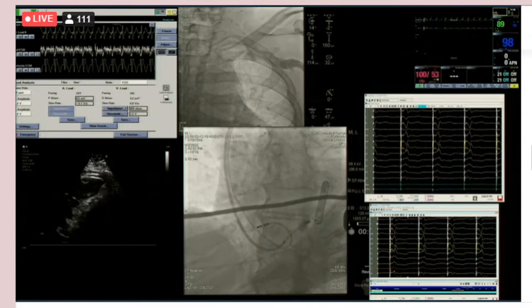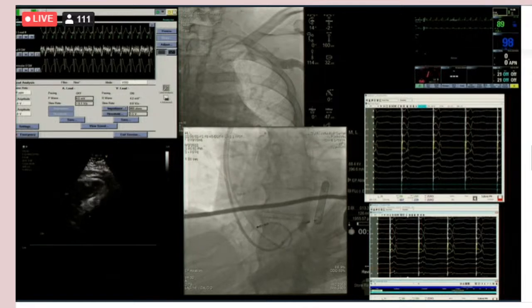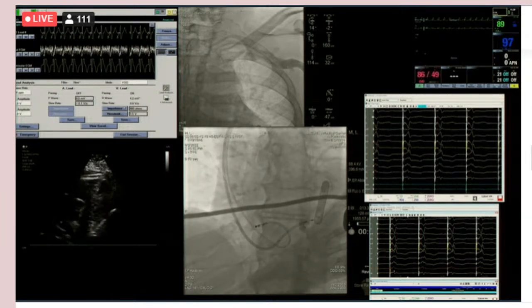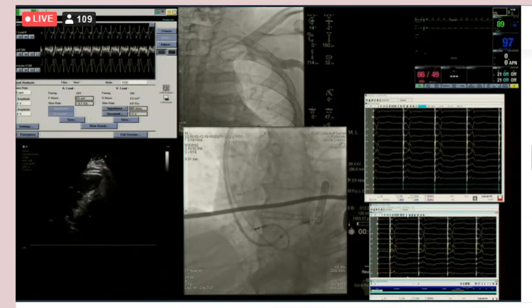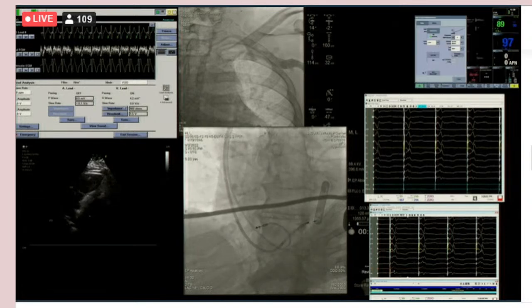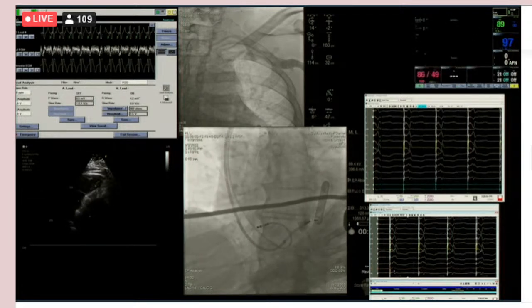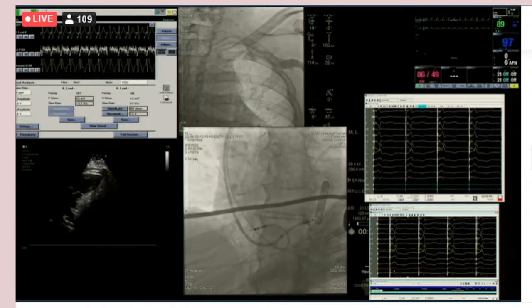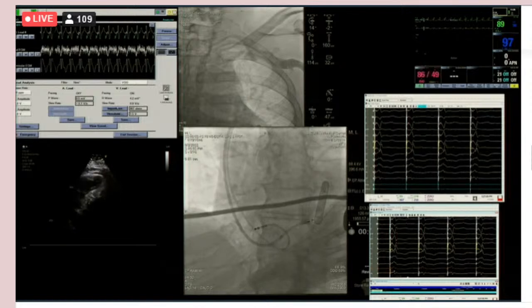Now, I just did an angiogram while you were asking that question. So you can sort of see the surface of the septum. You can see the ring is mostly, if not completely, embedded in the septum. Yeah. So both electrodes in the thickness of the septum. Can you see the tip of the lead? Yeah. Are you happy that it's not... Yeah. Okay. So we don't think it's through and through. We've still got a very nice left bundle. So I'm going to get rid of the contrast. 1.5.